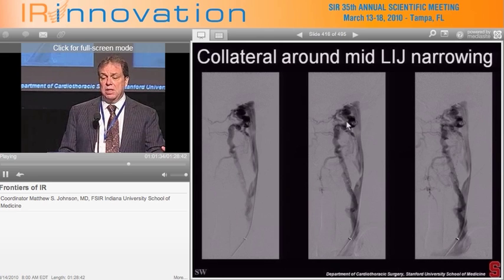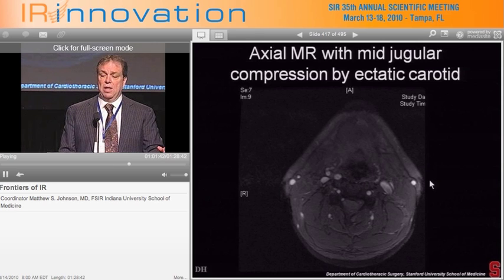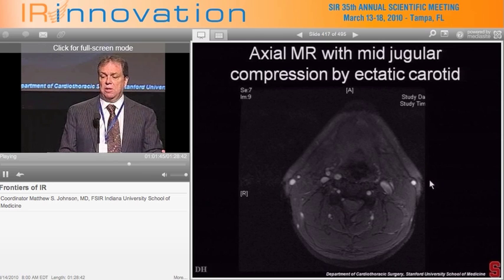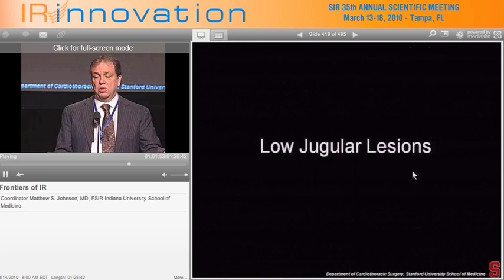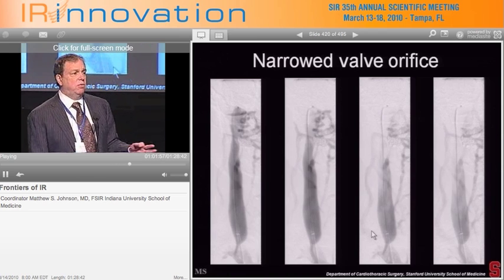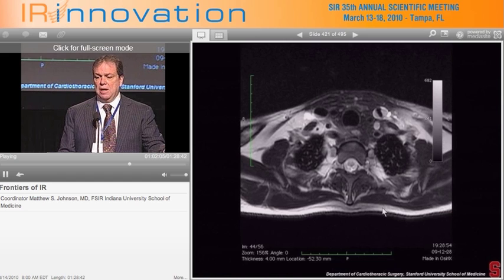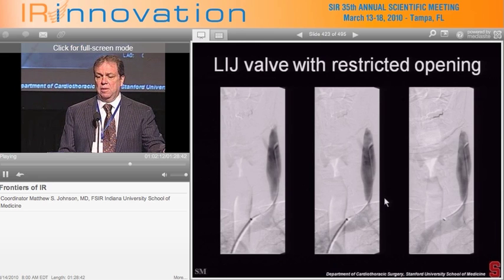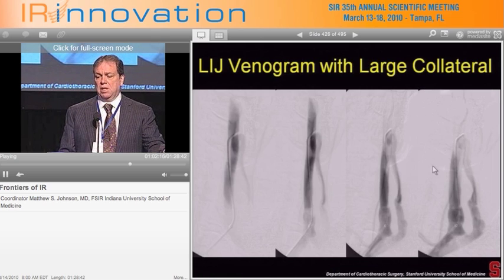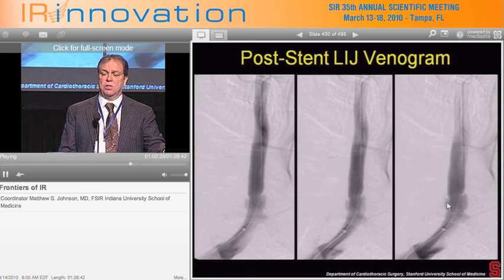Mid-jugular is another area we see obstruction, with a large bucket-handle collateral going around a narrowing caused by smearing of the jugular by an ectatic carotid bulb crossing it. Pre and post stenting images show the collaterals disappearing. Low jugular lesions are almost always associated with valvular abnormalities where the valve orifice or essential flow orifice is limited — prominent valve cusps with flow stasis on the left. These often respond to angioplasty alone, but sometimes not; a large bucket-handle collateral to the subclavian with a prominent valve cusp may persist after angioplasty but resolve after stenting.